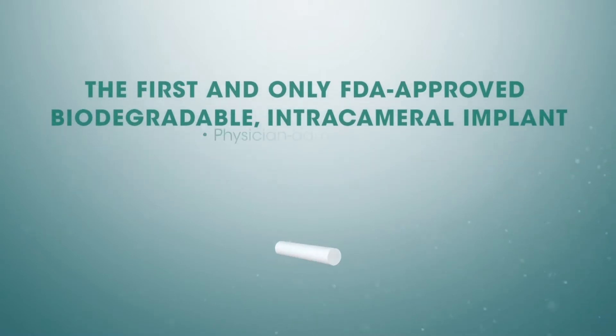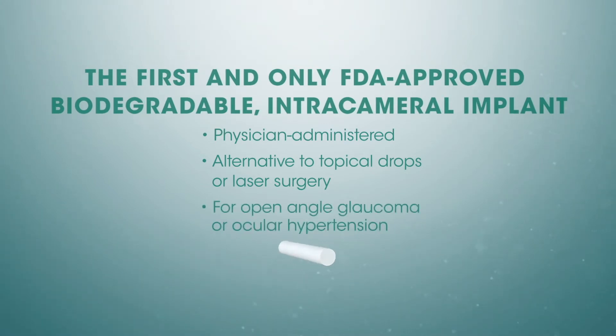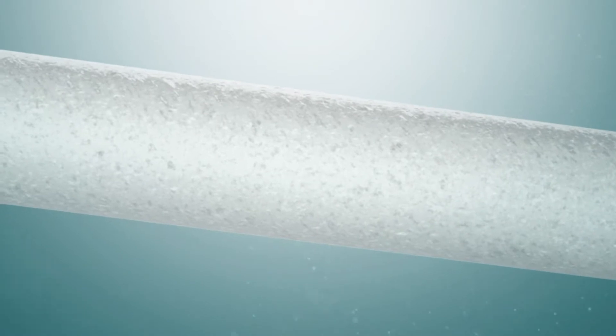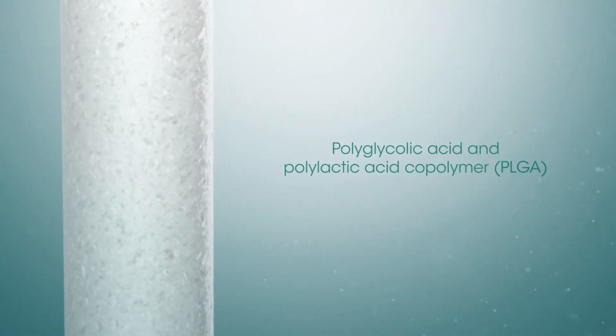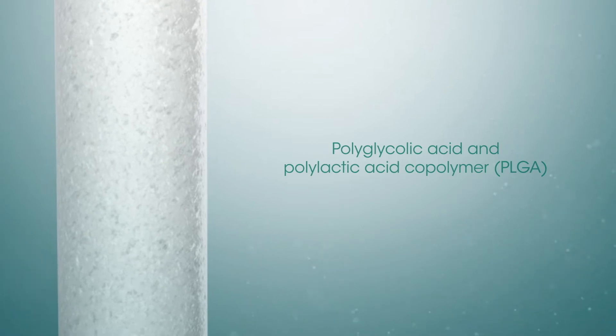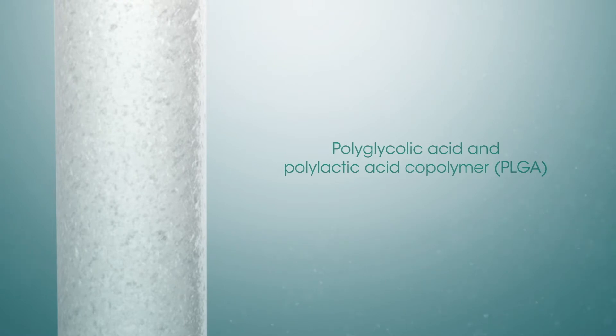Darista offers a physician-administered alternative to topical medication or laser surgery for patients with open-angle glaucoma or ocular hypertension. The drug delivery system was developed specifically for sustained drug delivery and employs an advanced polymer matrix that includes the biodegradable synthetic polyesters polyglycolic acid and polylactic acid. This polymer matrix maintains targeted delivery and slow, steady-state release of Bimatoprost over time.